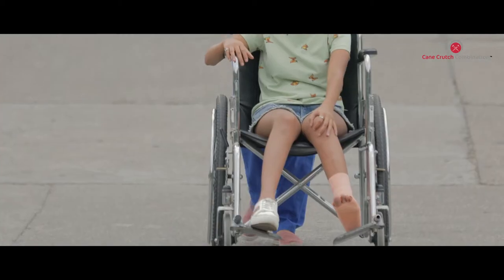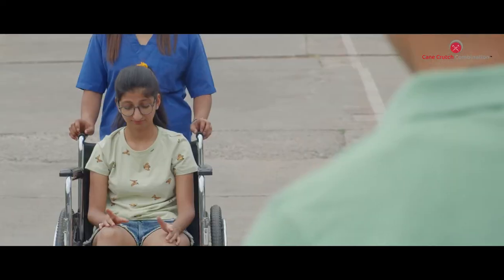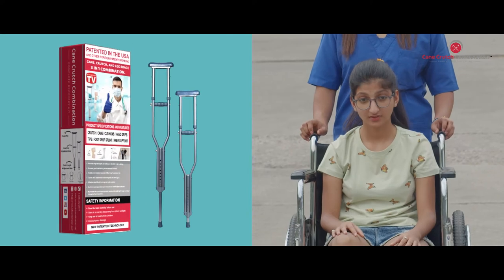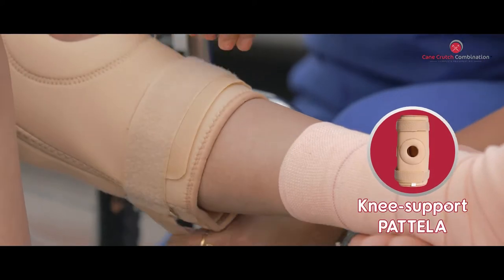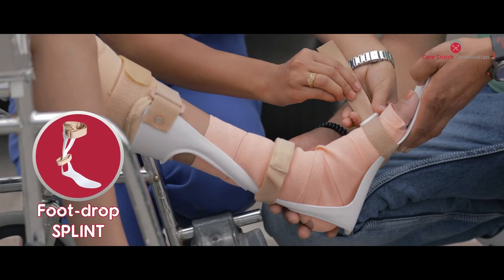Foot injuries are something that happen quite often, but it could be depressing to see your child stuck in a wheelchair for months. The all new cane crutch combination is a doctor's recommended advanced recovery kit that helps your child recover faster. It comes with a knee support patella and a foot drop splint that provides better stability and support.